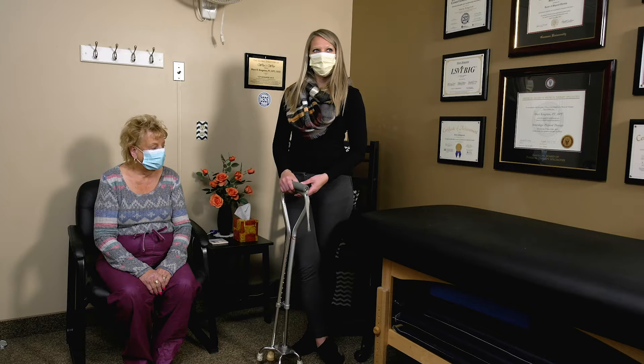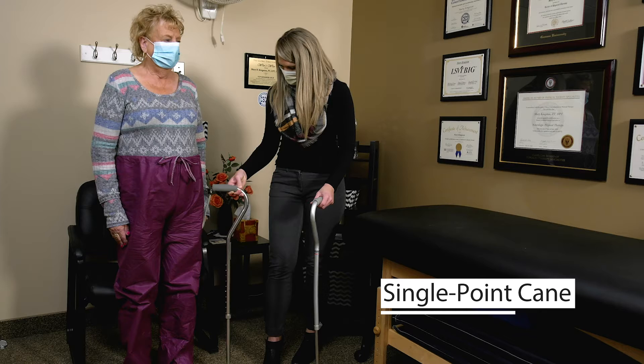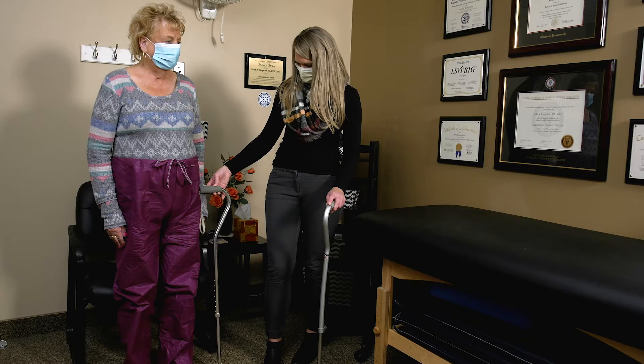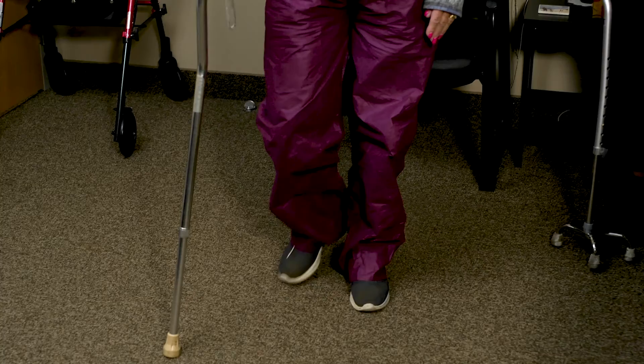We're going to go over how to make sure your cane is the right size. Go ahead and stand up, put your arms down by your side, and we want to make sure that the cane is right about the base of your hand when your arms are straight and you're standing. This is a good size cane for her, and she's going to show you how to walk with it — go ahead and take that for a test drive.